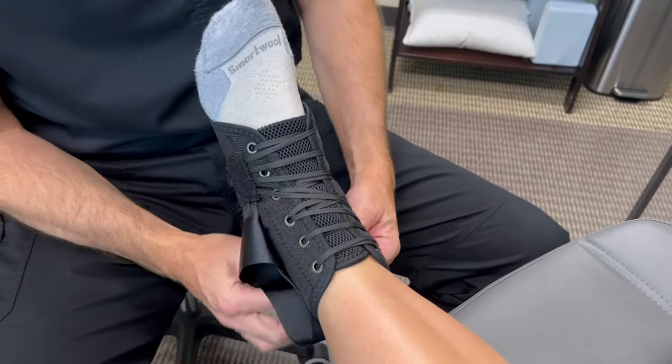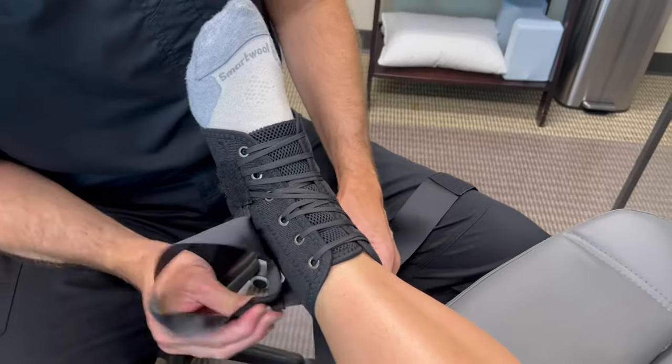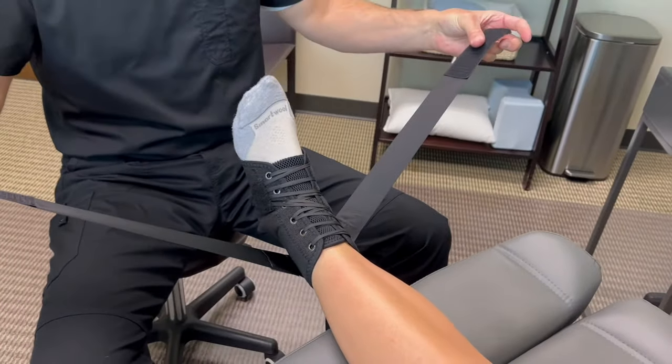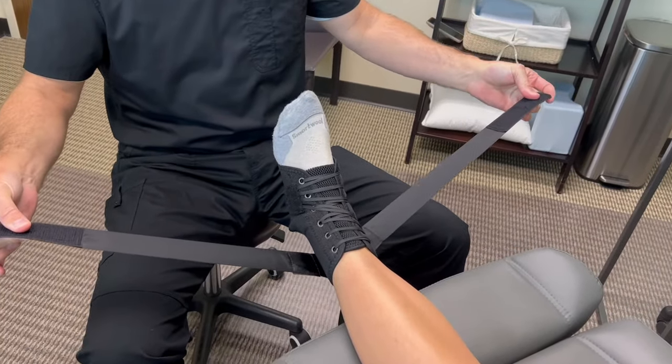After that you're gonna have three different straps here that you want to worry about. These two are the main two, and you're gonna put these on in different order depending on where your problem is.